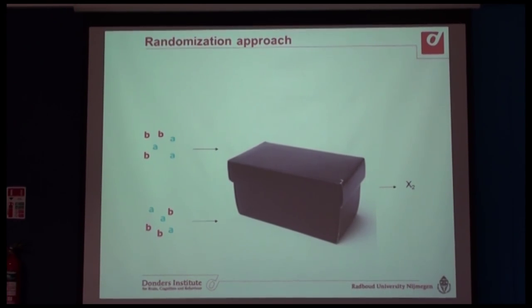So let's assume that we have observed the data in 100 trials. We have 70 trials in this condition and 30 trials in this condition. As long as I keep the number of trials in each of the two conditions the same, but I just shuffle the data between the two conditions, I'm always going to keep 70 trials here and 30 trials here.